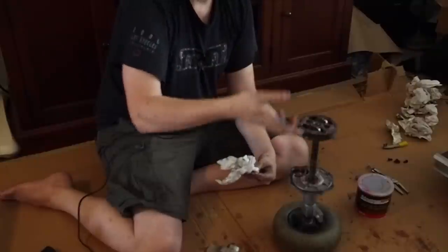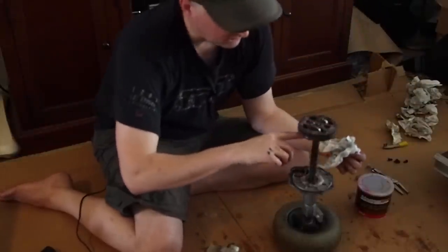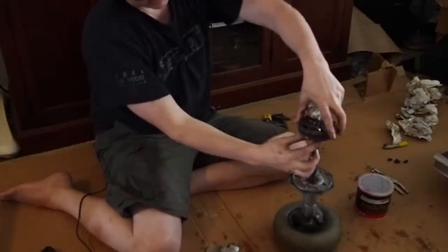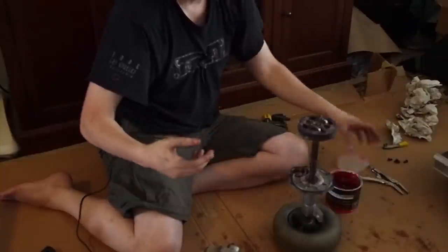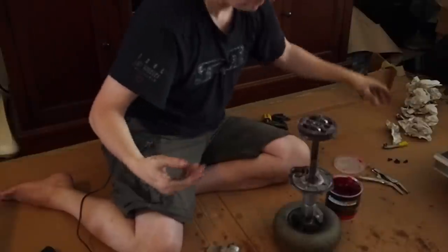So this gear here I had flipped upside down, and I put a bigger washer between this gear and the gear that's right here going this way. I'm not going to take it apart again because I don't want it to fall apart. So this is how much grease I used last time.